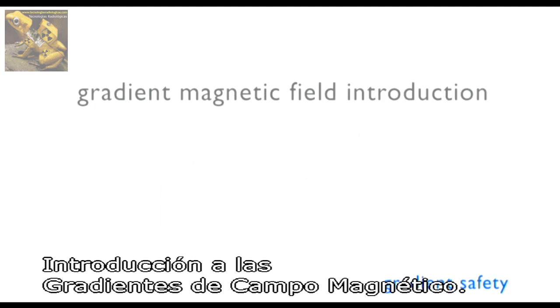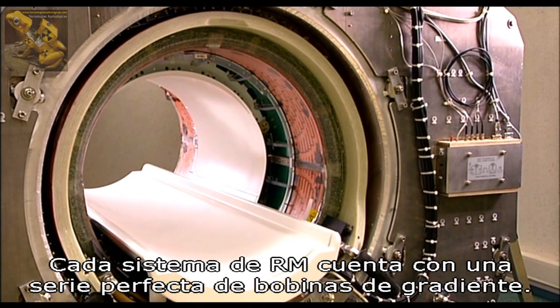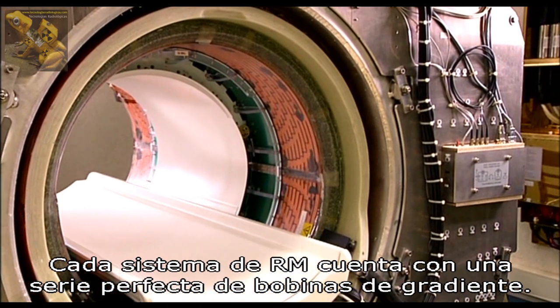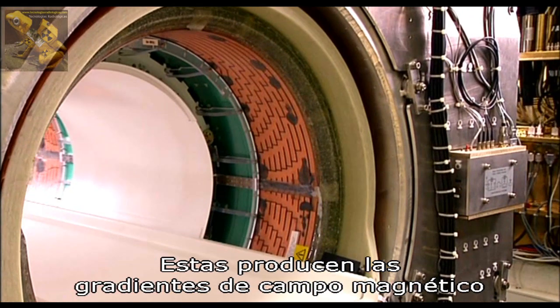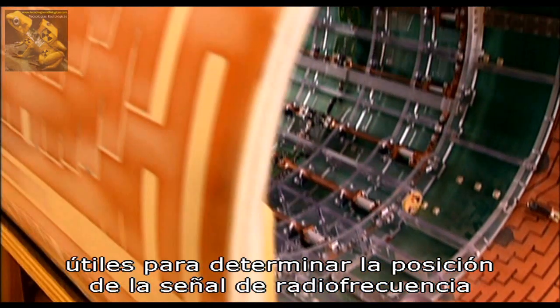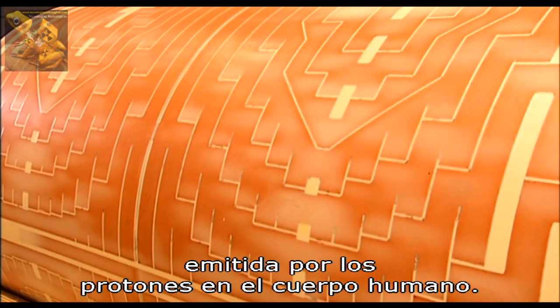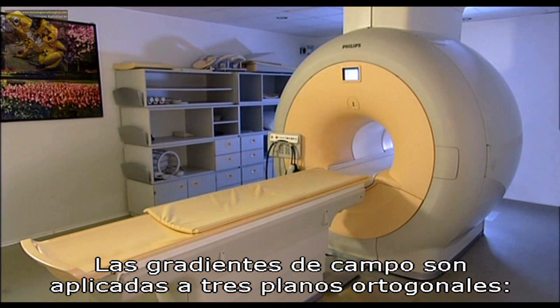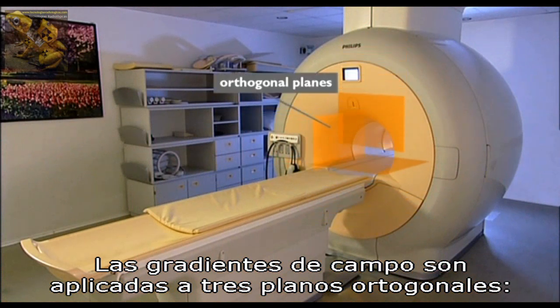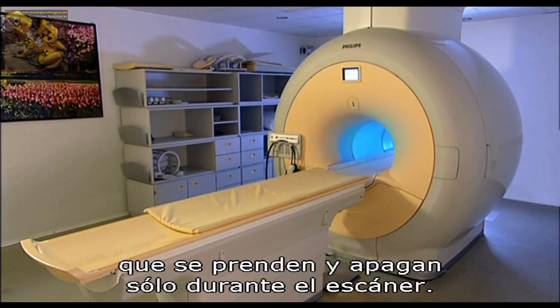Gradient magnetic field introduction. Every MR system includes a carefully designed set of gradient coils. The gradient coils create the switched gradient magnetic fields needed to determine the location of the RF signal emitted by the protons in the human body. The gradient fields are applied in 3 orthogonal planes, the X, Y, Z planes, and are switched on and off only during scanning.